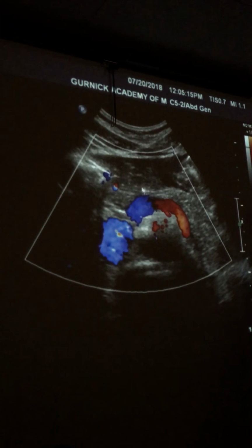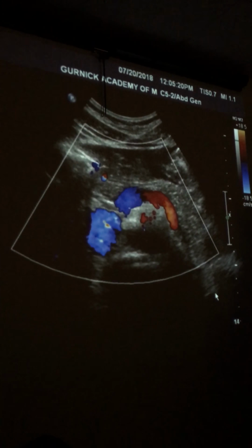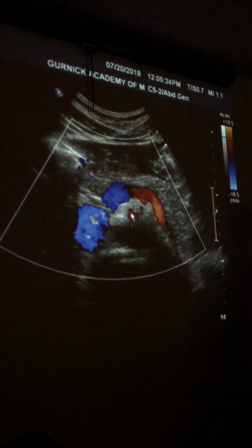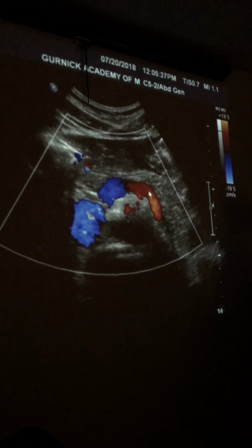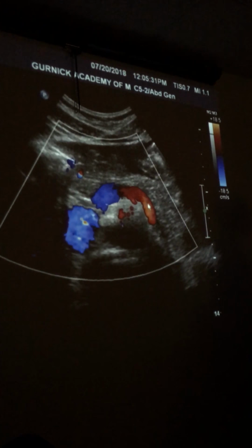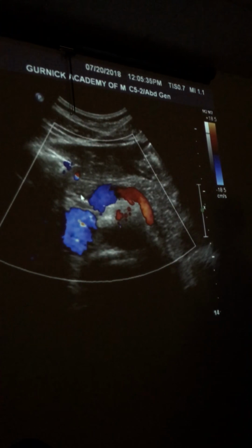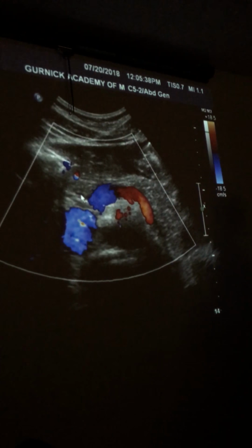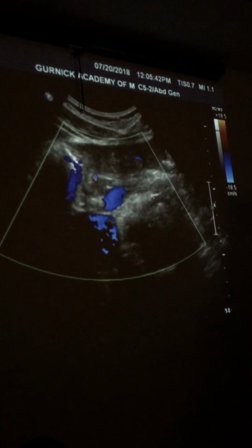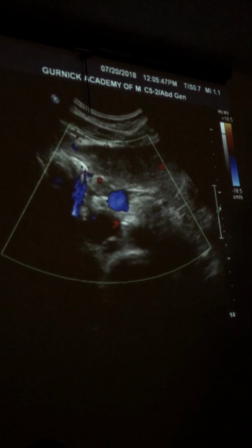So here we have the pancreas, right? Can everybody see this? Yes. So here's the pancreas tail. It's going way to the bottom of my film. Spine shadow, aorta. What's this one? SMA. What's this one? Confluence. Confluence near the head, but when I start going this way, splenic vein. What's this? Good, right below the GDA. So if I'm looking for my SMV, I'm actually going to start finding my portal vein confluence.